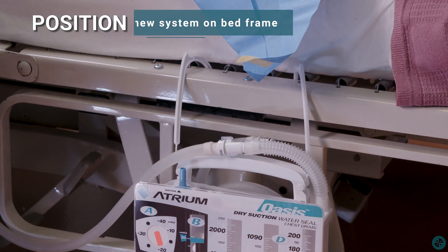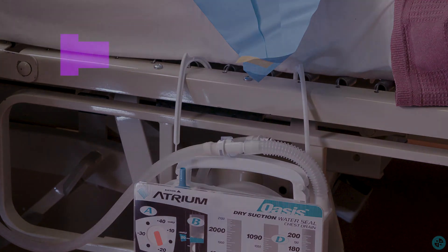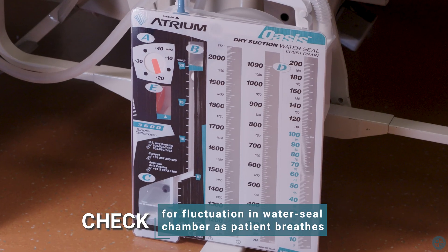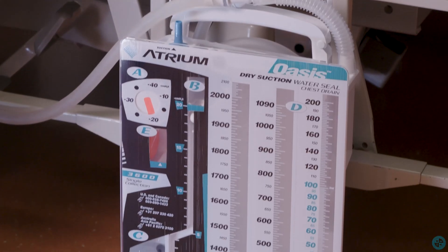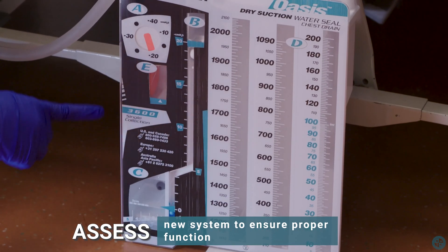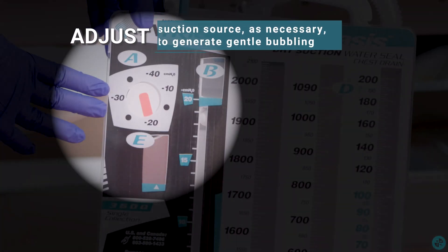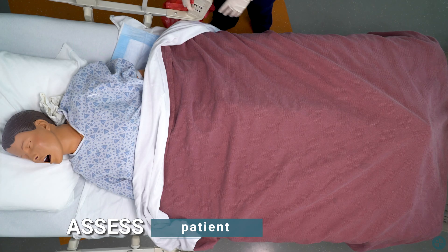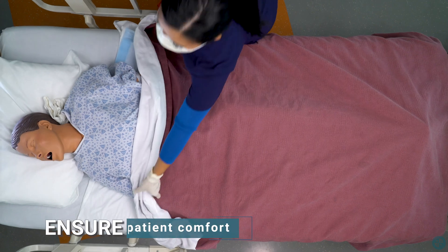Position new system on bed frame. Be sure the tubing remains below the level of the insertion site. Check for fluctuation in water seal chamber as patient breathes. Assess new system to ensure proper function. Adjust suction source as necessary to generate gentle bubbling. Assess patient. Ensure patient comfort.